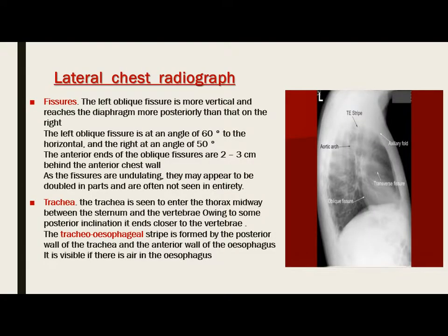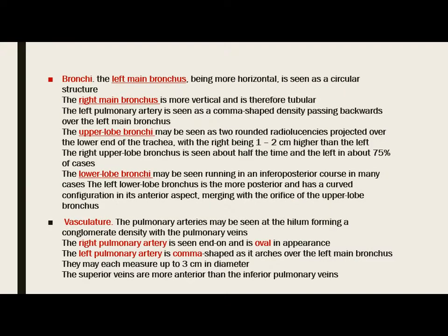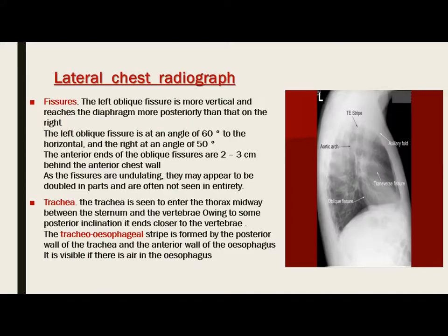On the lateral chest radiograph, the fissures, the trachea, the bronchi and vasculature are seen. The left oblique fissure is more vertical and reaches the diaphragm more posteriorly than on the right side, seen as a linear radio-opacity that reaches the diaphragm. The anterior ends of the oblique fissure are two to three centimeters behind the anterior chest wall. As the fissures are undulating, they may appear to be doubled in parts and are often not seen in entirety on the lateral chest radiograph.